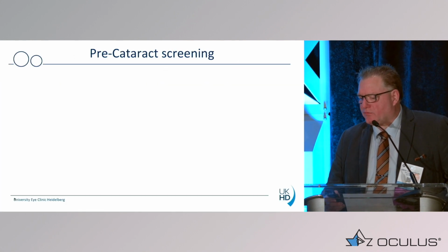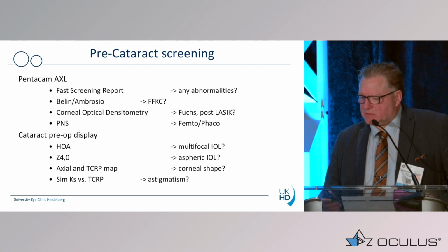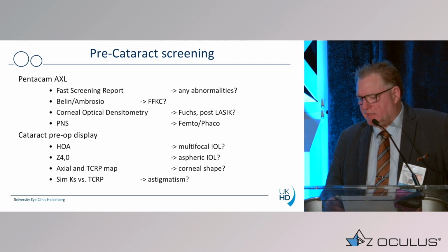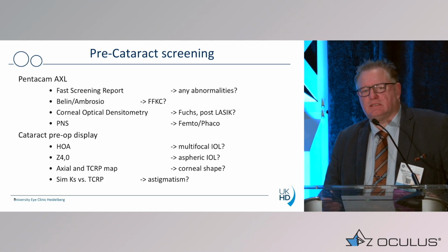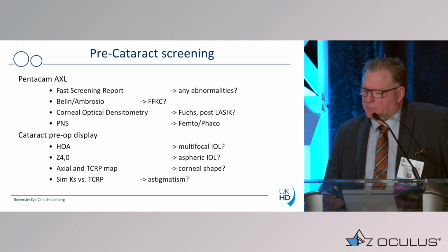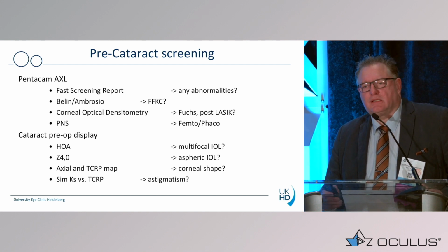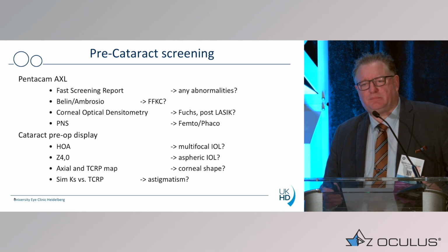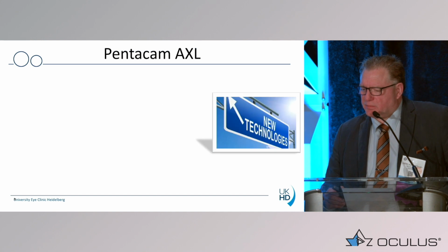And I will kick off this with a little case report because I was very much impressed by the pre-cataract screening possibility that you have and what you can look at, especially if you think about using it for multifocal lenses, aspheric lenses, or any kind of astigmatic correction. So we have a huge number of things we can focus on when we go, especially into refractive lens exchange, stuff like this. The presbyopic lens exchange is actually now quite a big thing in Europe.